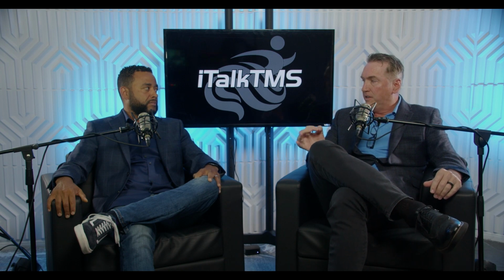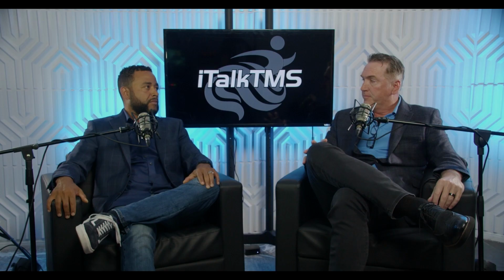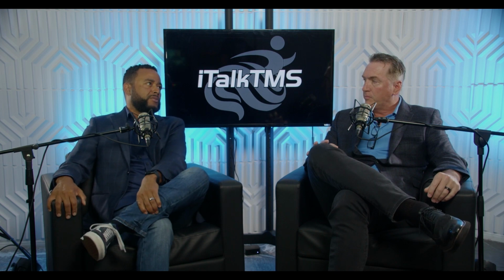And over a daily process of doing this, we can tighten up the waveforms in those locations, take out some noise in the system, and in a sense tune the brain. And we'd like to treat more than one location, 5 different locations ideally, and this takes about 20 minutes to do each day. When you say noise in the brain, what do you mean?